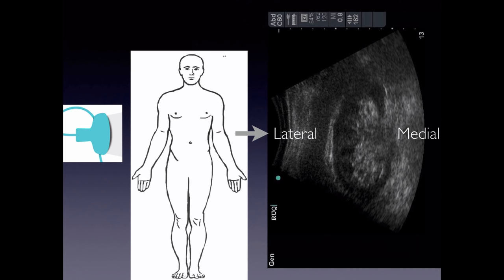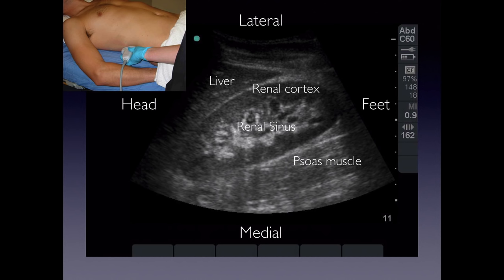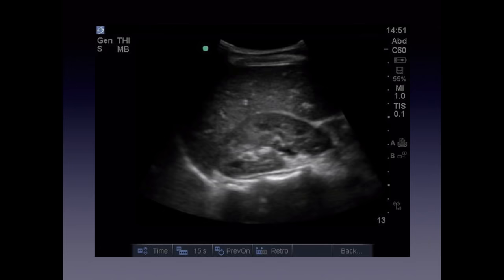For orientation: since the probe is positioned laterally cutting the patient coronally, the top of the image is lateral and the opposite is medial. With the indicator towards the patient's head, the left of the screen corresponds to the patient's head and the right to the feet. You can also see the psoas muscle, which appears striated, and the liver adjacent to the kidney — scanning through both helps identify the anatomy.